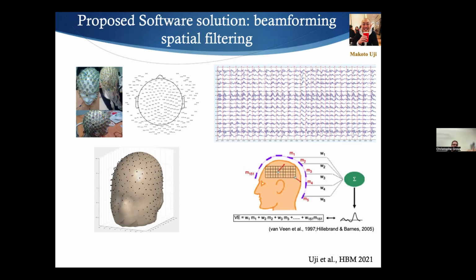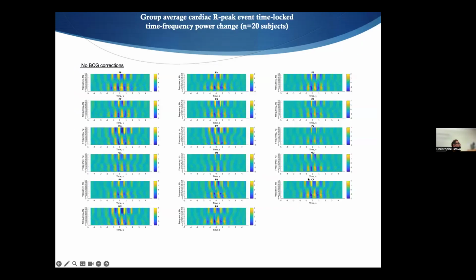So this is for carbon wire loop, but I will mention now the work of Makoto on beamforming. What Makoto has been doing, first he tried the effect on the ballistocardiogram artifact. Here these are time frequency representations from all the electrodes. He took all your QRS, created all the time frequency maps, and averaged them. You see that when you have no correction, you get a very strong signal, you see the oscillation.